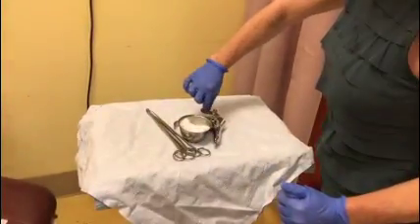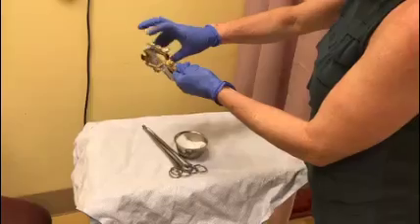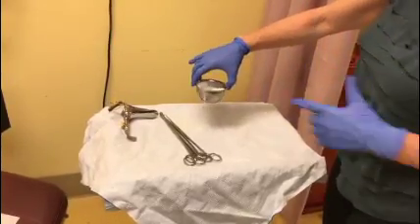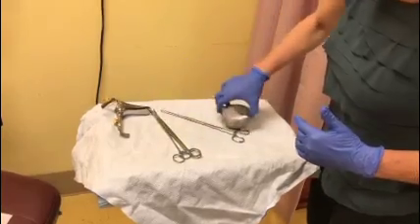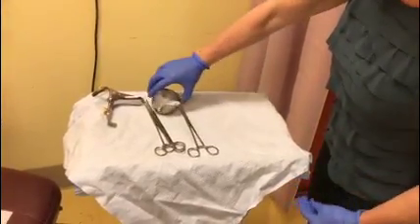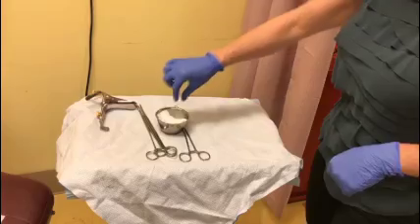The non-sterile side is going to be closer to the patient. I'll pick up my speculum, touching just a small piece of it, open up the bills, and place them in the corner of the non-sterile side of my tray. Anything that's going inside the uterus or holding onto the cervix goes to the sterile side. I gently hold the top of the cup and move my tenaculum over to the sterile side, with handles facing the non-sterile side so I don't inadvertently contaminate the sterile side when I pick it up.